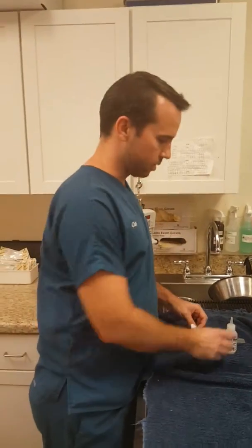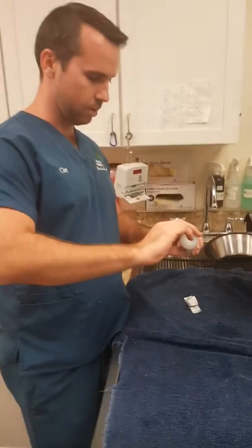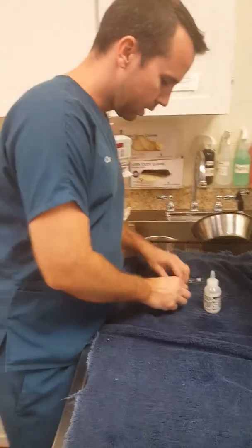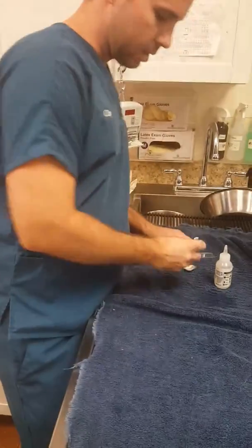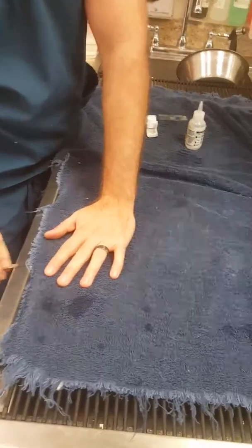I'm going to do a skin scrape on Taffy here. So I got my slide, I'm going to put a little bit of mineral oil on it. And then I got my blade. I cleaned this counter so I'm going to dab it a little bit on the side there.